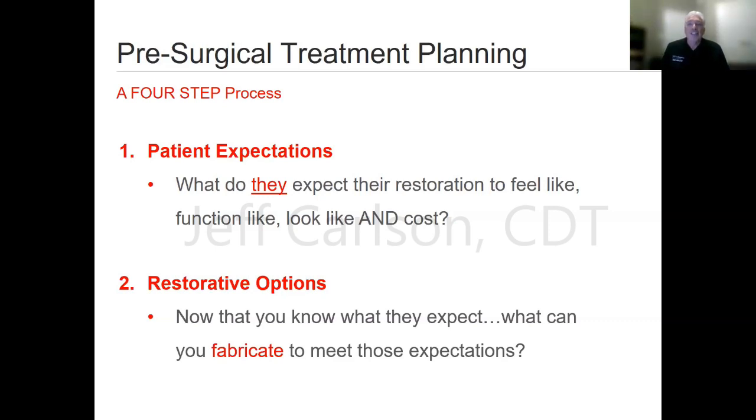And this is where patients don't really understand, whether it's tissue supported versus bar supported, implant attachment retained, fixed, fixed removable. I mean, these are all our words, right? But the idea is that they have expectations, and their terminology might be different than our terminology. So I'm gonna kind of go through that with you as well.